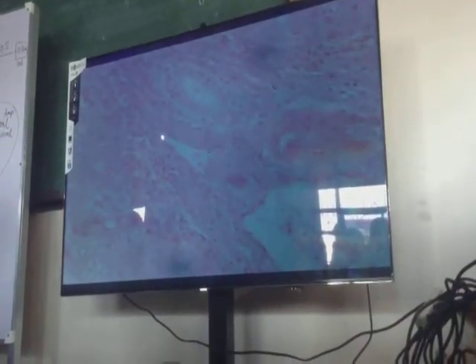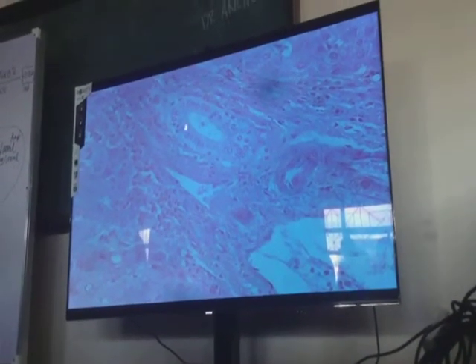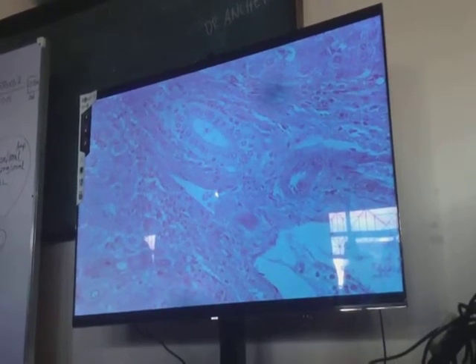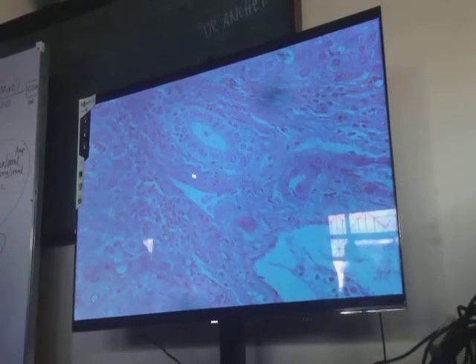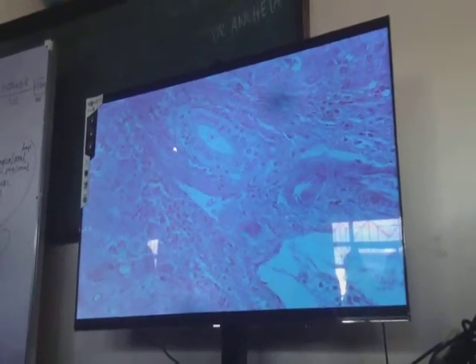Okay, so look at the appearance of the bile duct. That's the appearance of the healthy epithelial cells of the bile ducts. Unlike in primary biliary cirrhosis that we have seen a while ago, where the epithelial cells are already distorted because they are being destroyed by the infiltrating white blood cells. Notice there is no extensive fibrosis surrounding the bile duct. There are few white blood cells only surrounding the bile ducts. Majority of the leukocytic infiltrates are located at the periphery of the portal area.